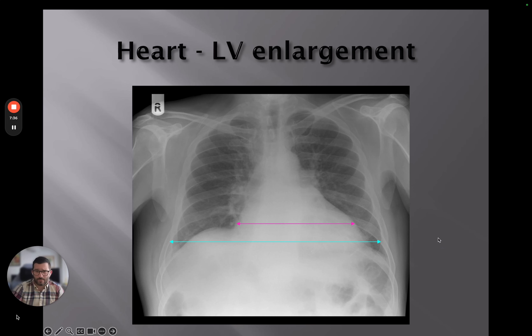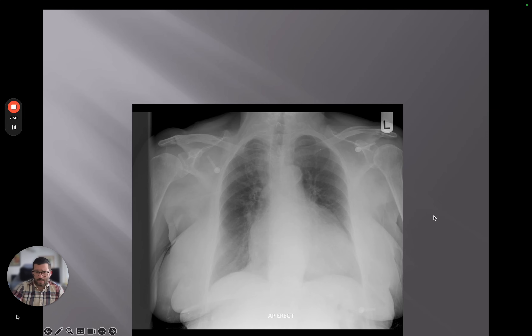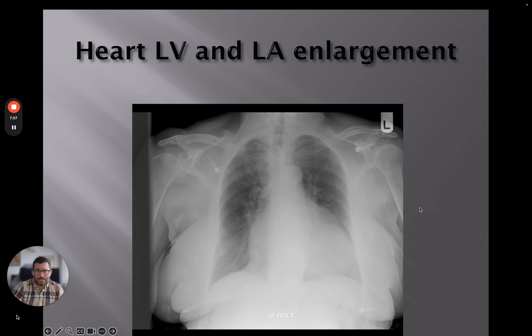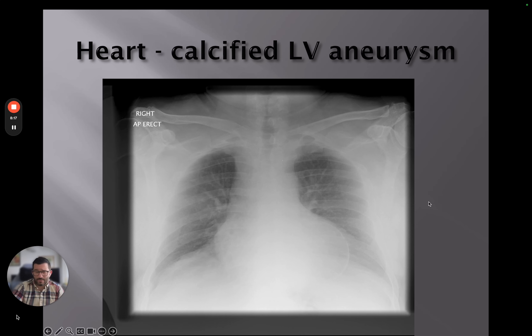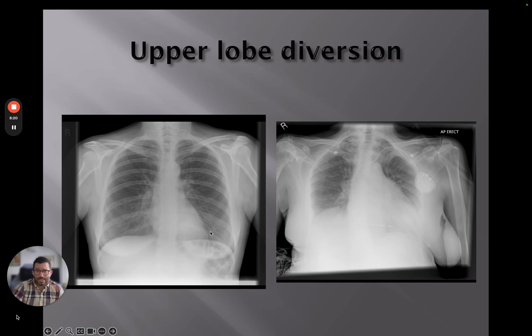Looking at the graphical representations, we've got left ventricular enlargement here — a larger or higher than average cardiothoracic ratio. Although this is an AP projection, we can also see a more globular shape, indicating left ventricular and left atrial enlargement. There's also a denser material visible, showing a calcified left ventricular aneurysm. The side-by-side of previous films shows upper lobe diversion.